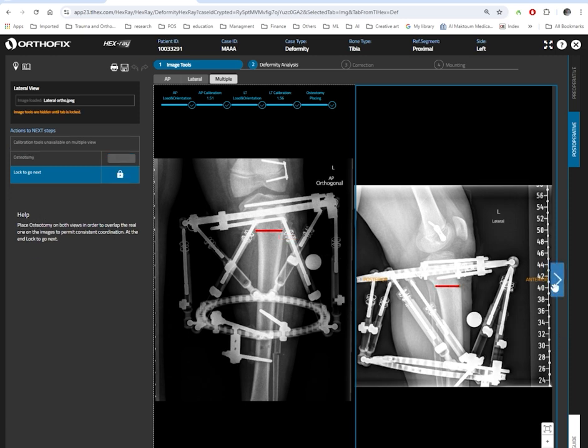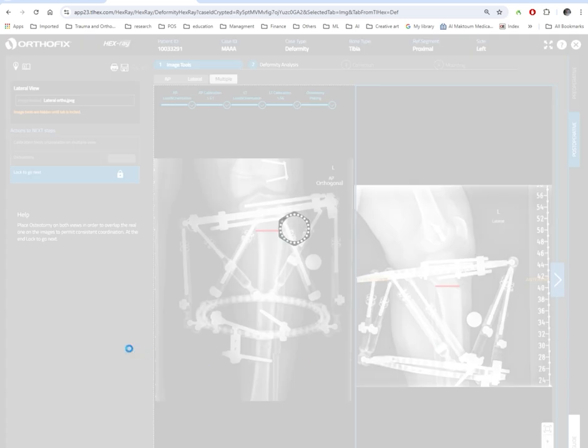As you lock it, it will move again. It will give you a sign to move that way. I'm going to click on this one.